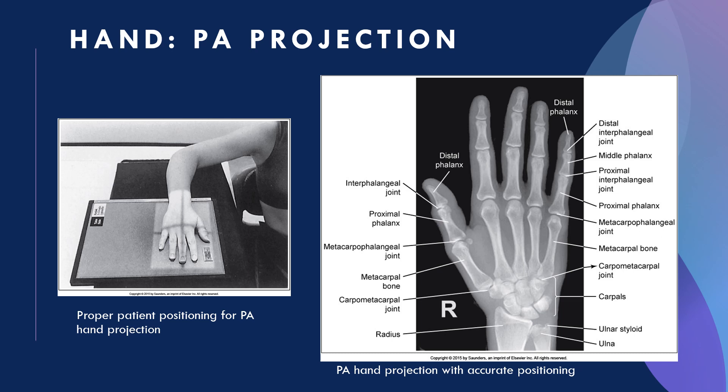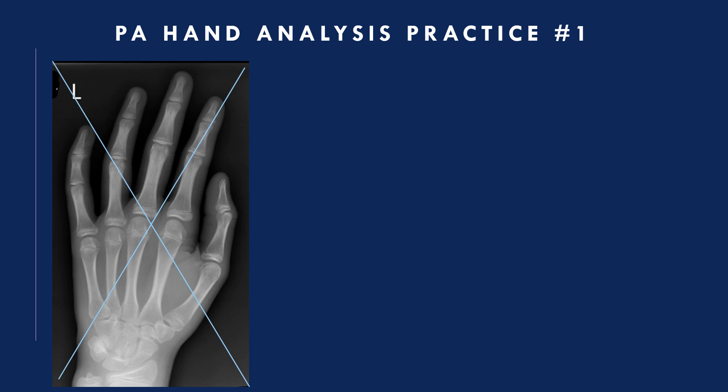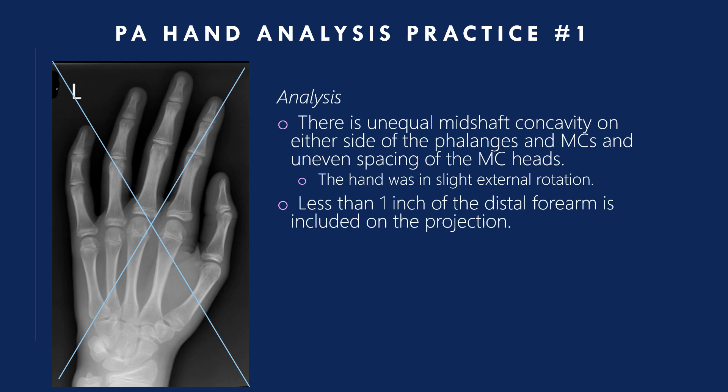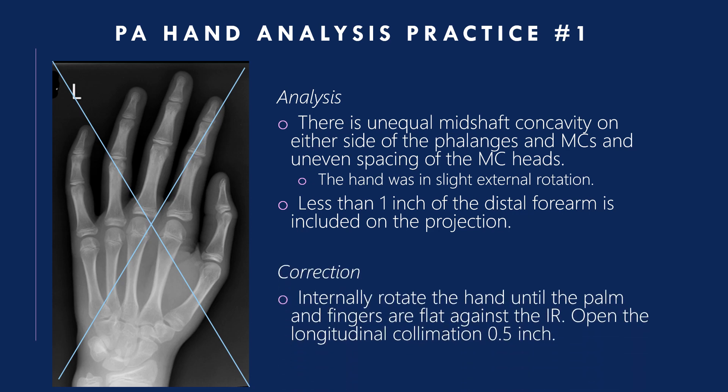PA projection of the hand: here are examples of proper accurate positioning. Analysis practice one: there is unequal mid-shaft concavity on either side of the phalanges and metacarpals, and uneven spacing of the metacarpal heads — the hand was in slight external rotation. Less than one inch of the distal forearm is included. Correction: internally rotate the hand until the palm and fingers are flat against the IR, and open the longitudinal collimation a half inch.